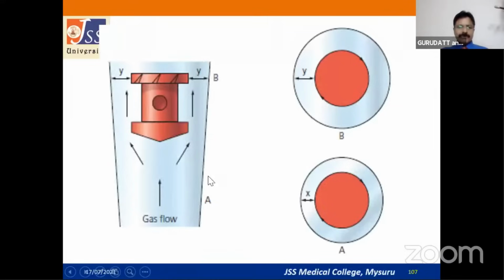So now coming to the flow meter and the bobbin. What is the principle behind this floating of the bobbin? There is a force from above because of the weight of the bobbin. These bobbins are made of aluminum. It's very, very light, but the gravity force is there, which is trying to push the bobbin down. But the gas pressure is also there, pushing the bobbin up. At any particular flow, an equilibrium is created, and the bobbin will stay there, and it keeps rotating.